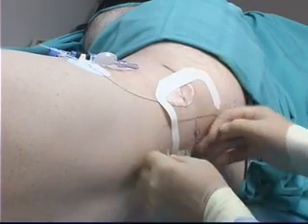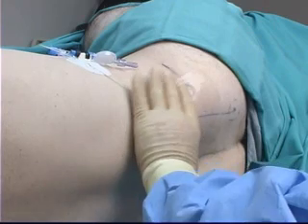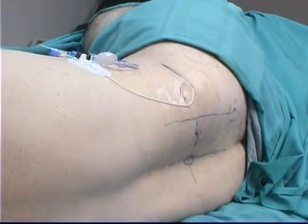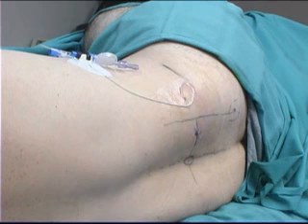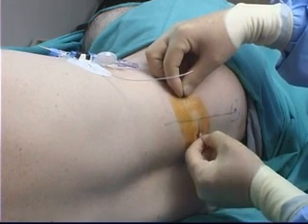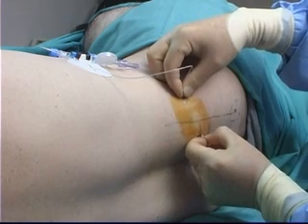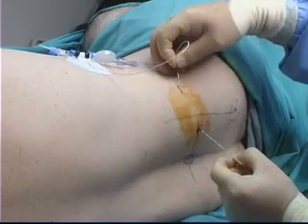The catheter and snap lock are attached to the StatLock, which is applied to a convenient position on the patient's flank. The catheter exit wounds are covered with a transparent dressing to facilitate daily inspection of the site. Catheter removal is done when the patient does not need the continuous nerve block any longer and after full motor and sensory function has returned to the limb.